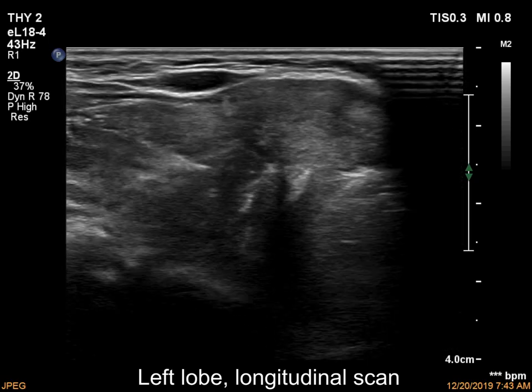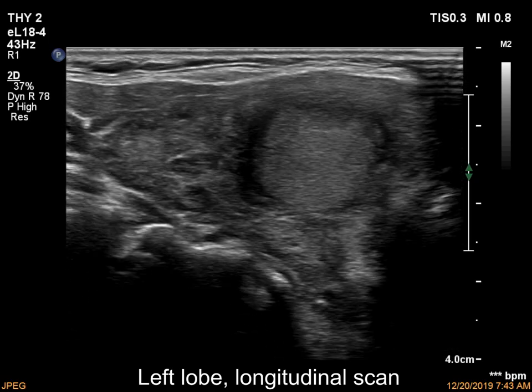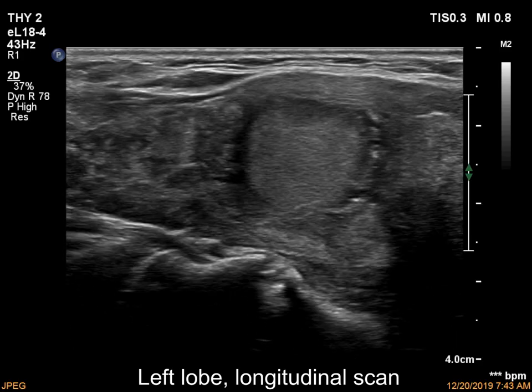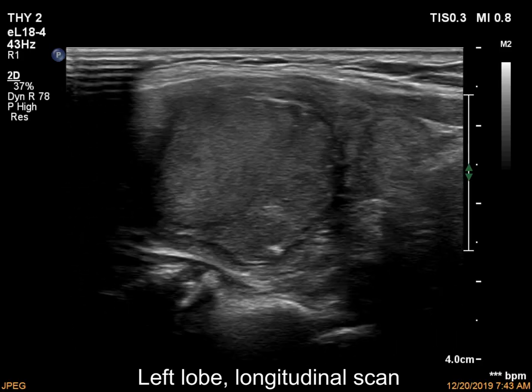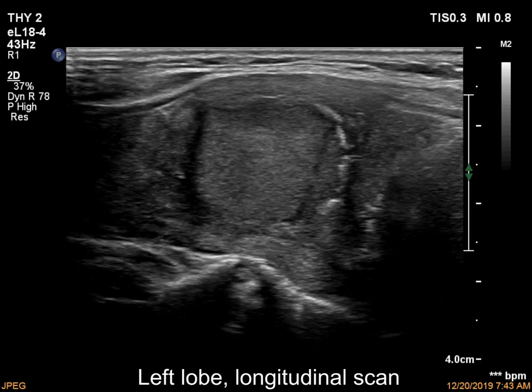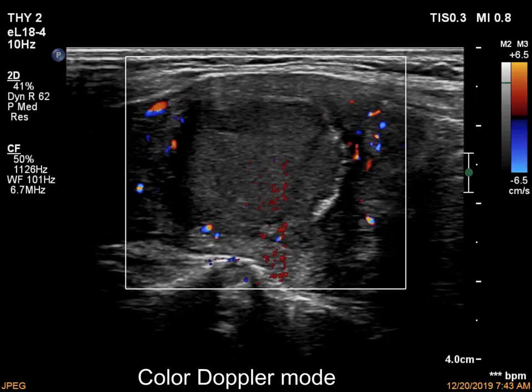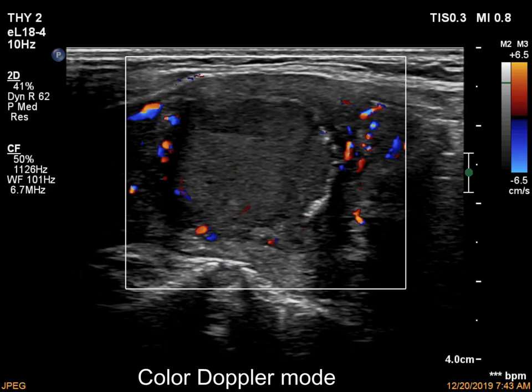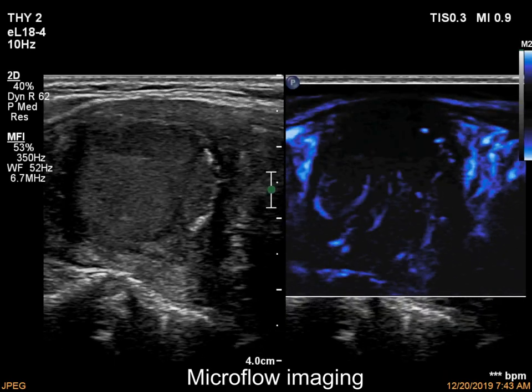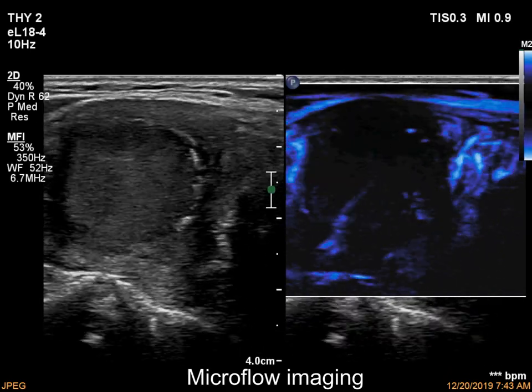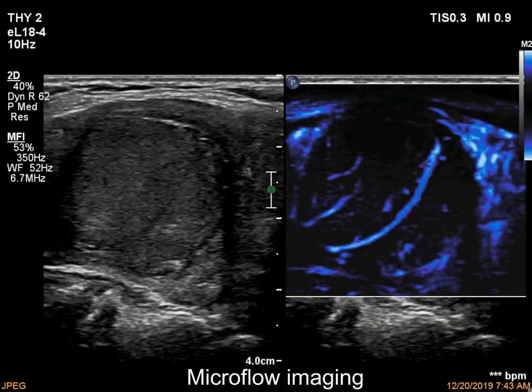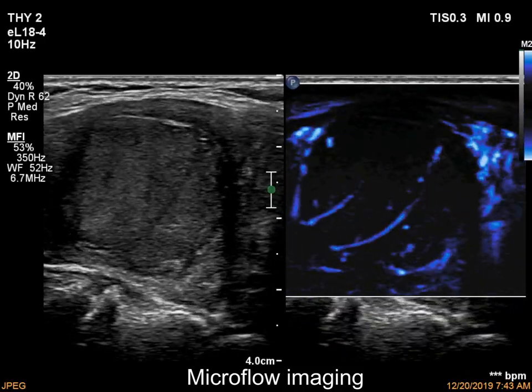The interpretation of intranodular echogenic figures is difficult. The vascularity is scanty.